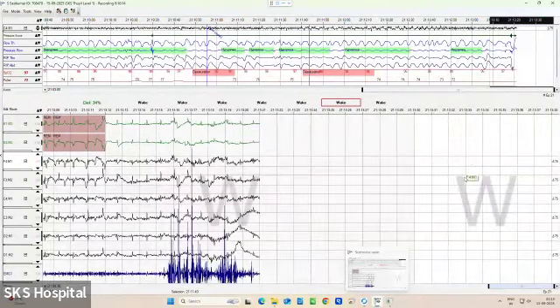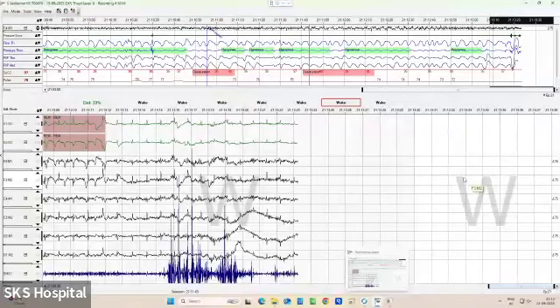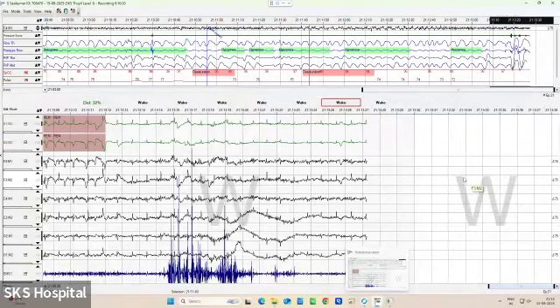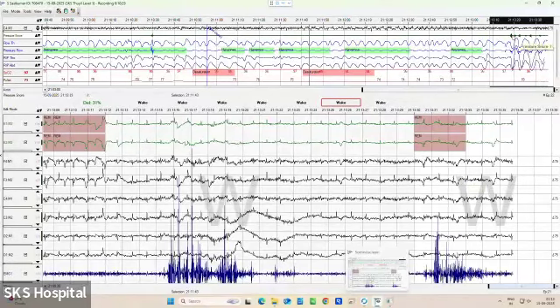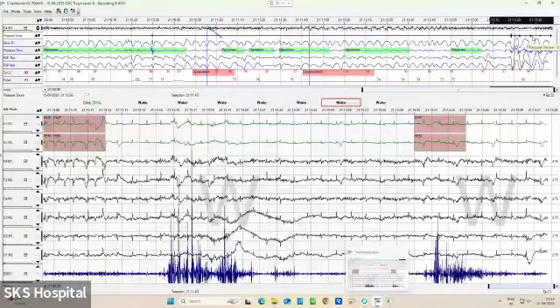The patient is asked to mimic snoring by vocalizing, where you can see movements on the chin EMG. And you can also see on the pressure snore sensor, where you can see snoring that is appearing here.